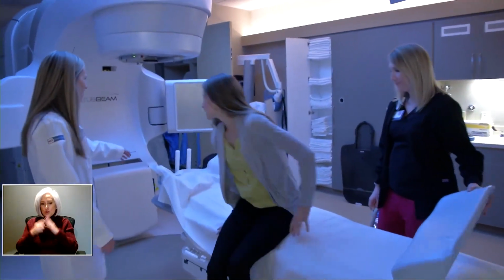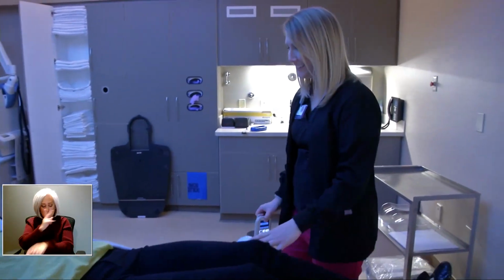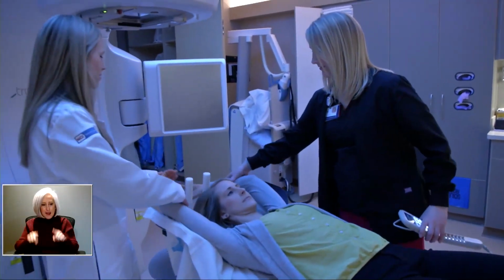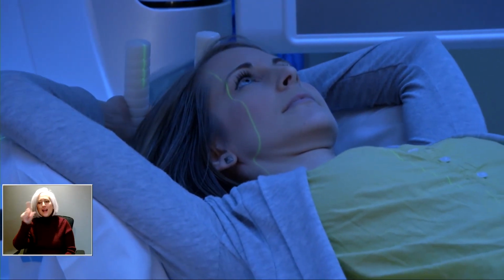But Dr. Chen, I want to start with you today. Let's talk about the procedure itself. And we're going to start by comparing it. We want to show some video of a more common external radiation where a patient lies on a table, then a machine shoots a radioactive beam at the cancer. But Bob actually did get some of this type of treatment on top of the brachytherapy. But Dr. Chen, why not stick to just external radiation to treat patients like Bob?